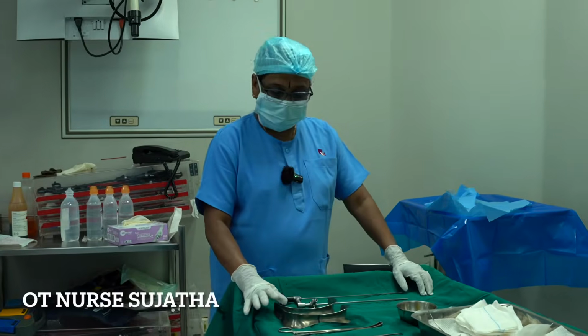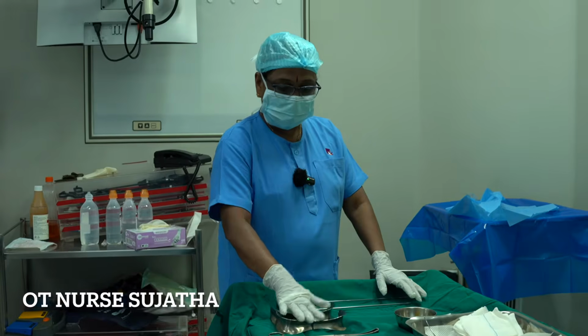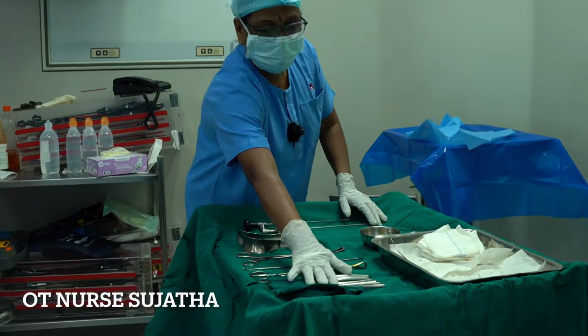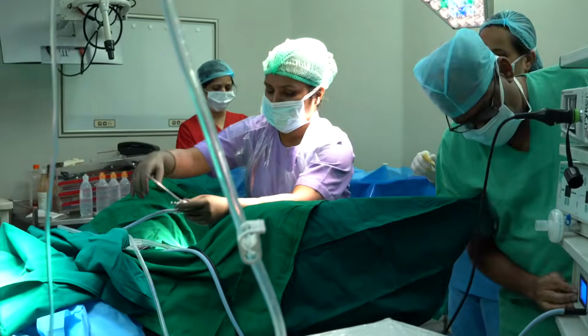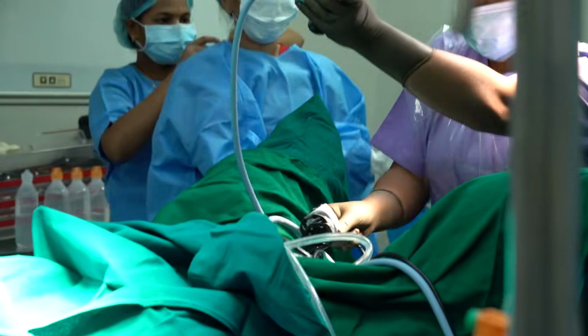This is the sterile trolley for the procedure. This is the hysteroscope and telescope. This is the speculum, and this is the volsellum, and this is the curette, and this is a sponge holder. This is a dilator for dilating the cervix. So to start the procedure, I have scrubbed up using a sterile gown and gloves. I start the procedure here now.